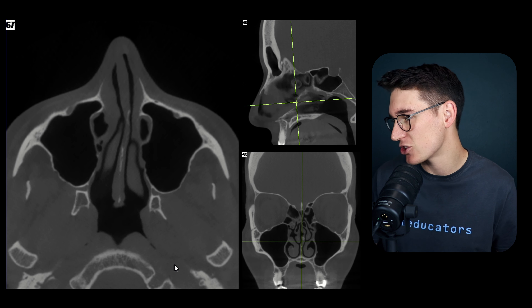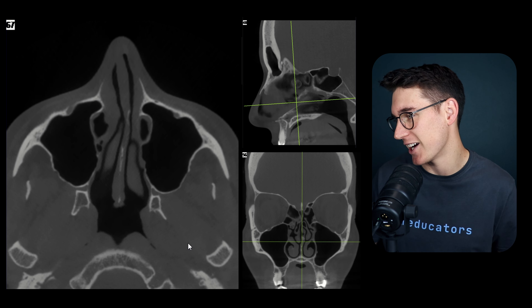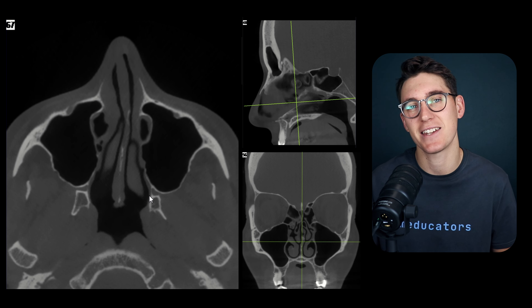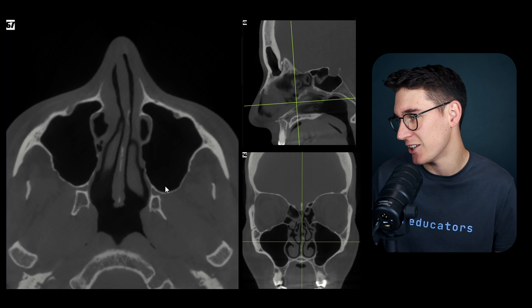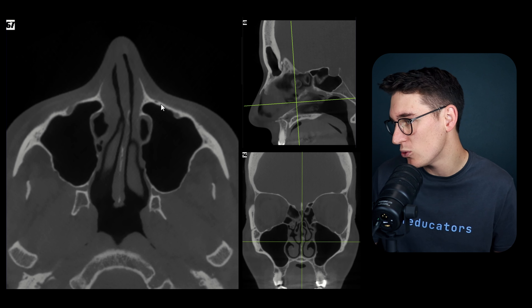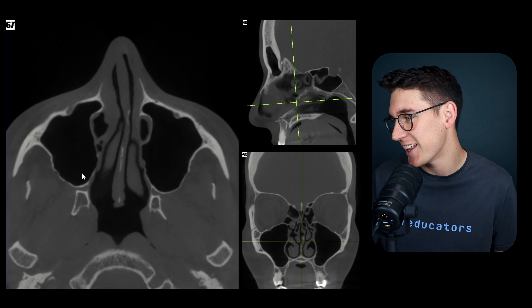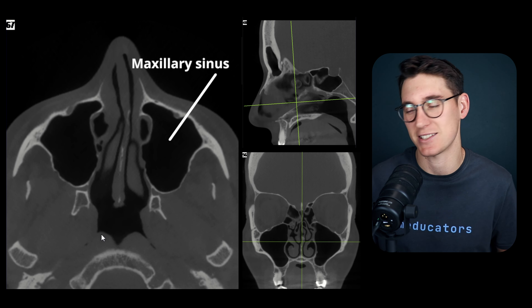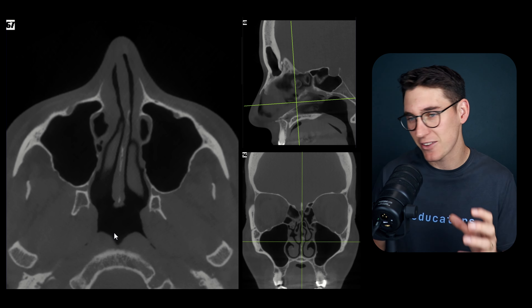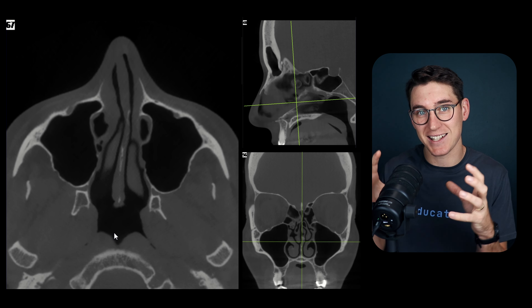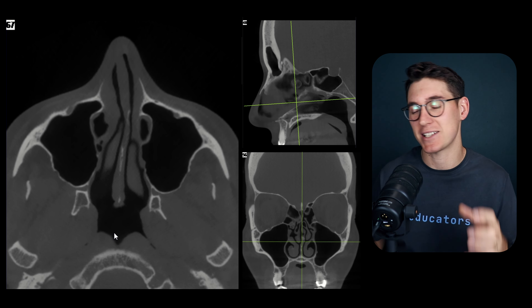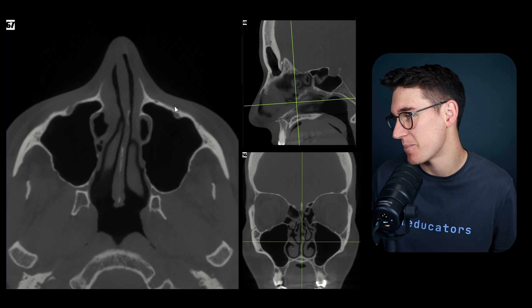Starting with the axial slice, we can see that on either side of the nasal cavity we have two large paranasal sinuses. These are the maxillary sinuses. The body of the maxilla houses the maxillary sinuses.